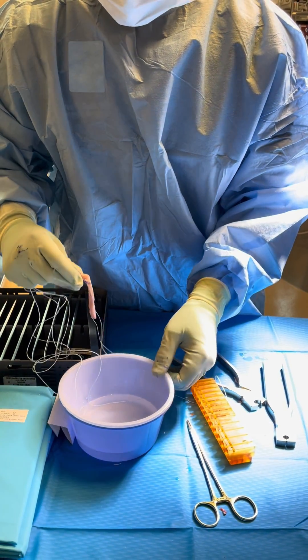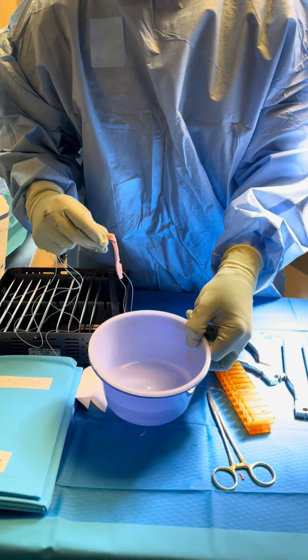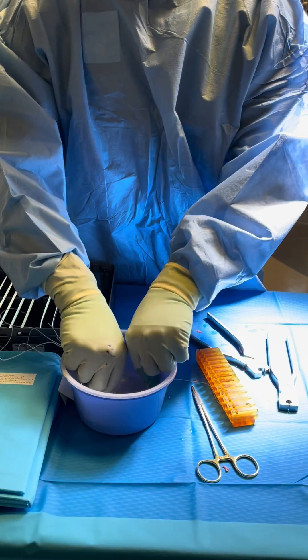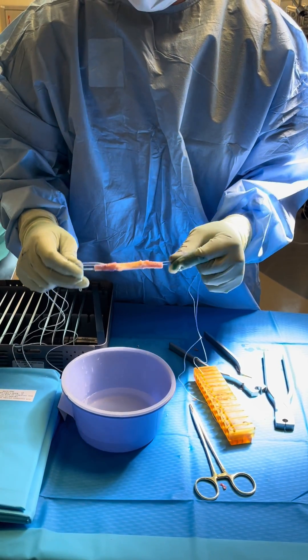The other thing that I do, which is becoming more mainstream now in the literature, is I use 200cc's of normal saline — this is sterile — mixed with 1 gram of vancomycin. That's an antibiotic, and this we use to soak the patient's graft to help prevent infection post-operatively.